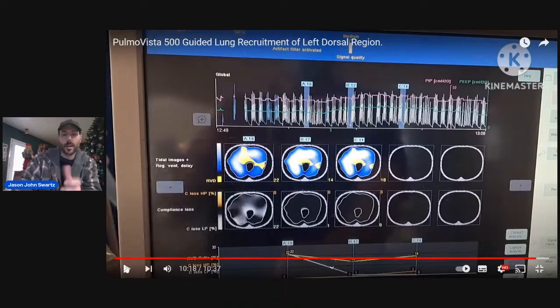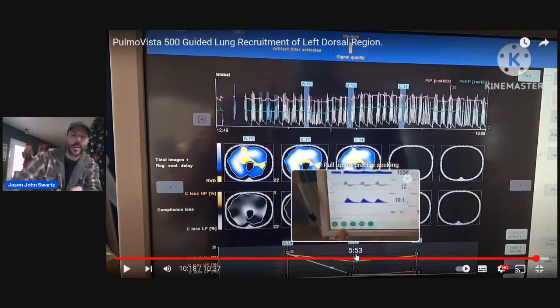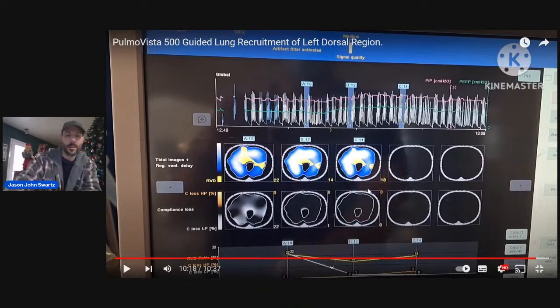And then you can do customized analysis. It'll show you a gain in compliance in blue and a loss in compliance in orange. That's another way of looking. So what you would see here is bad compliance, and the minute you go to 12, 14, you'd see a blue vector go up, showing that here, when you went to there, there's a gain in compliance, and so on.